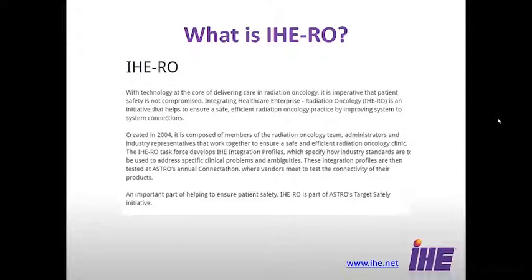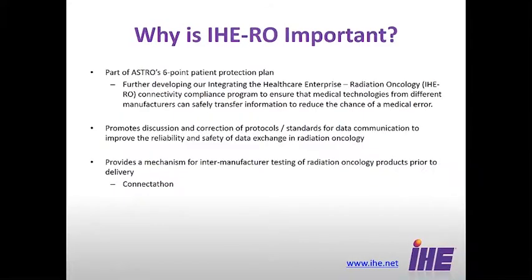As I'm sure you're all aware, transmission of the correct information and interoperability is a huge deal, because it is possible to have something that's DICOM compliant, but still not have interoperability, or at least good interoperability. We also believe this has a strong influence on patient safety because of the way we specify things and the way we treat their needs. Why is it important?